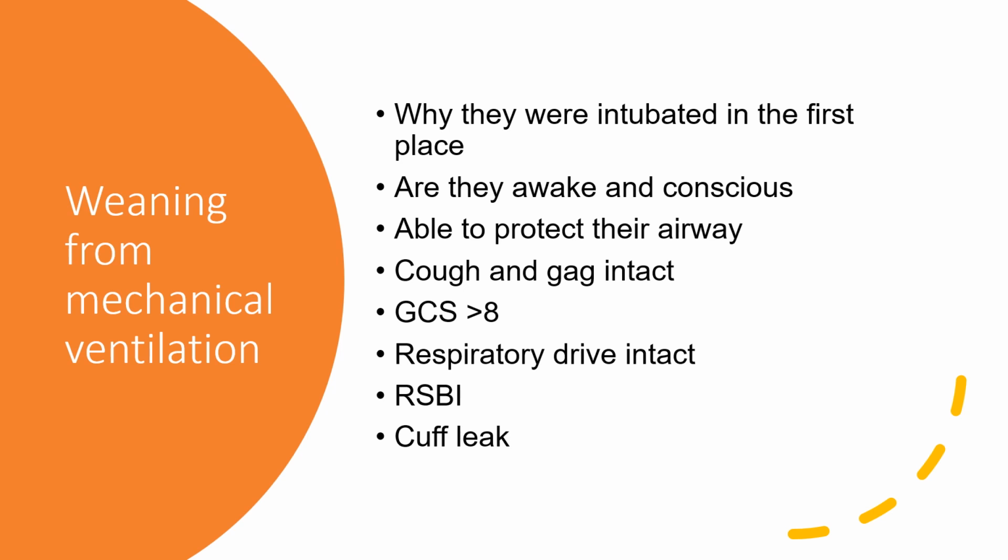How about a respiratory drive intact? Some people need to be able to spontaneously breathe. If someone's sedated or if someone has some analgesics on board and their respiratory drive is not good, they're going to fail. So you really need to check it. There's another thing called the rapid shallow breathing index, and basically if you have a score less than 105, that's an indicator that you are good to come off the ventilator. A lot of success has been shown with an RSBI of less than 105.